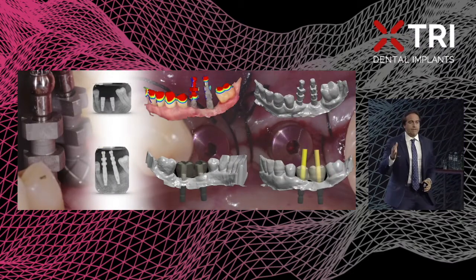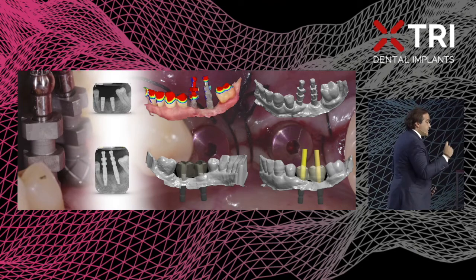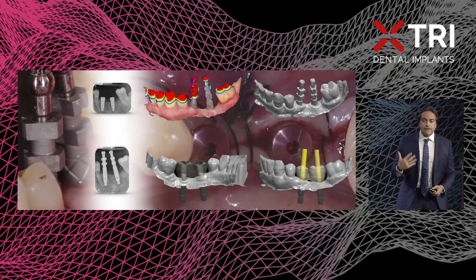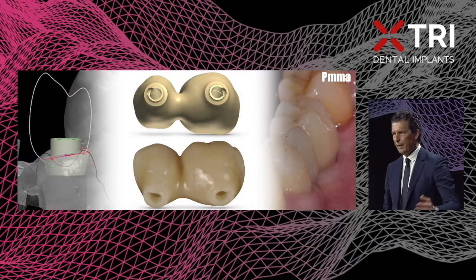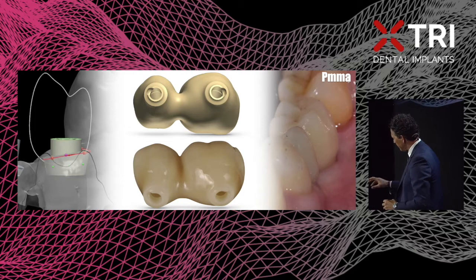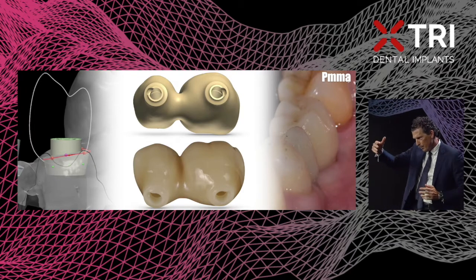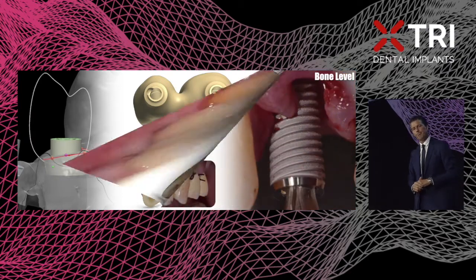You see that we have the 3D touch in position. You see the double check, the X-ray double check, the intraoral scanning, the CAD design, the CAD elaboration project, till the production of a PMMA. Yes, you can see the production of the PMMA, the production of the accuracy of the connection in PMMA. But in PMMA it is so easy, probably easier. Is easier. And so we move forward.